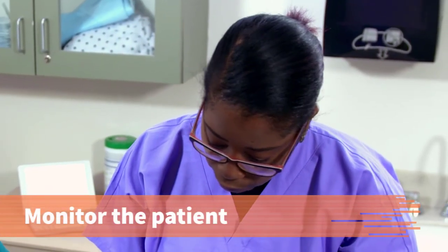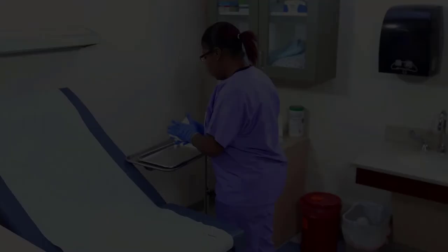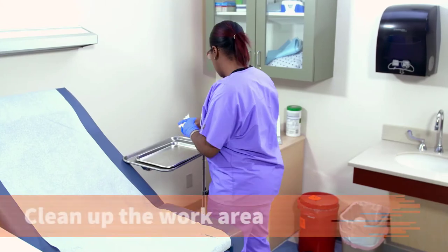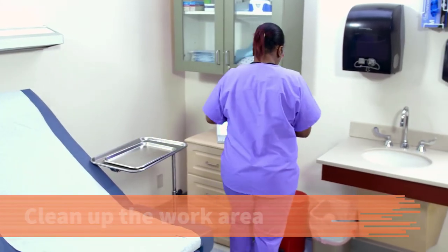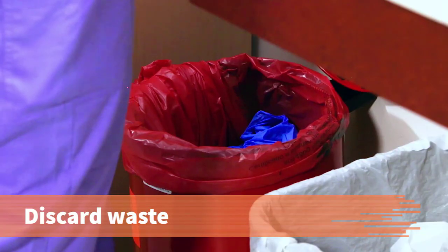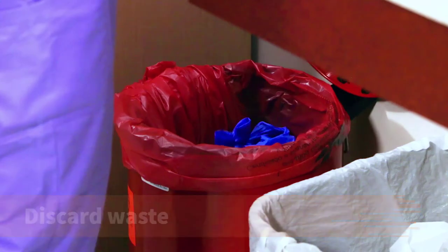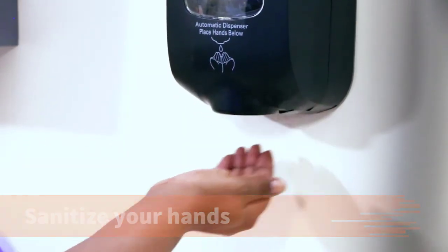Observe the patient for any adverse reactions. Clean up the area. Discard all waste, including your gloves, in the biohazard waste container. Sanitize your hands.